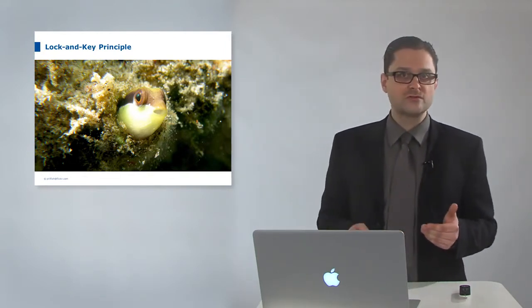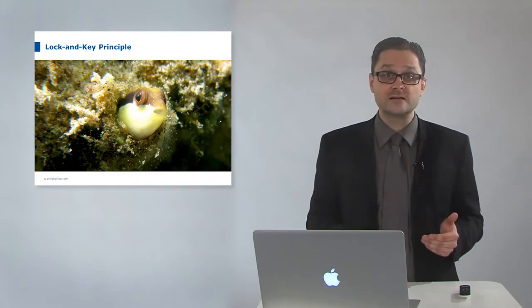That's how a post should fit into a root canal. The post should be placed without friction to avoid forces to the root which might cause fractures. On the other hand, the post should not have too much space, because the cement layer should only have 50 to 100 micrometers to avoid breaking of the cement material.